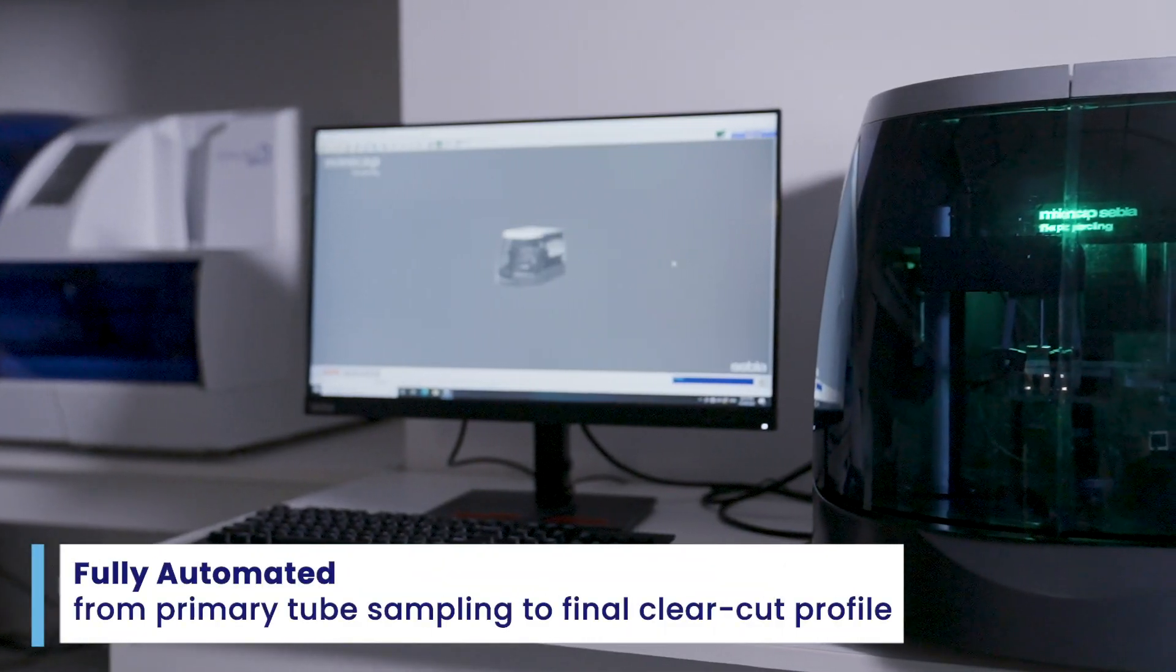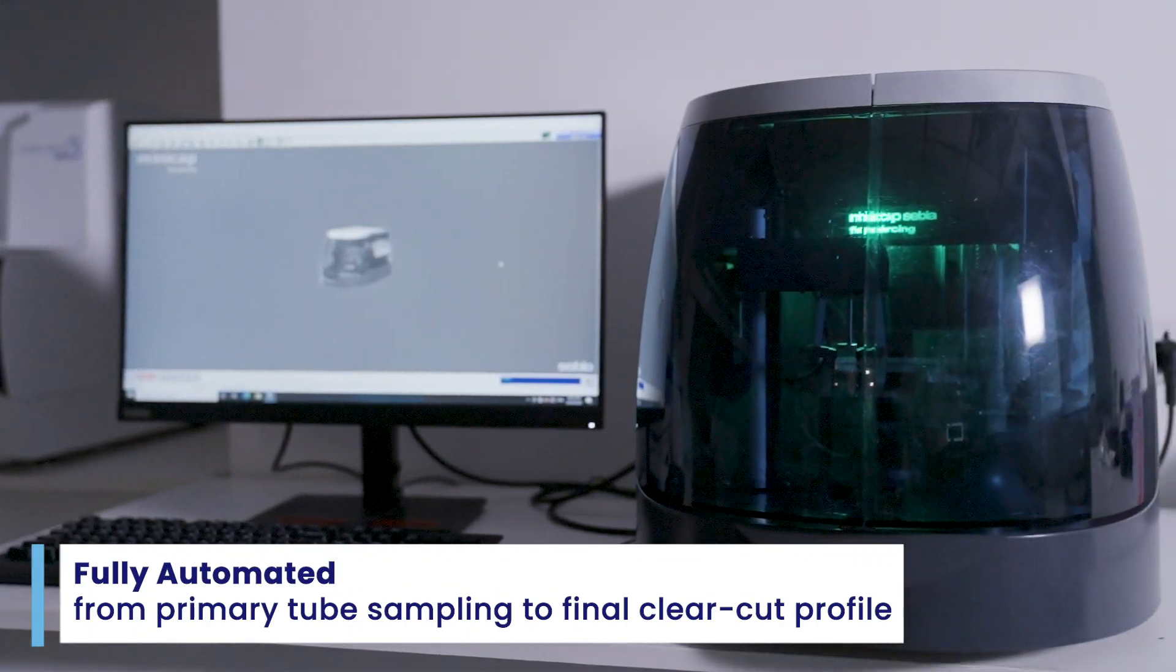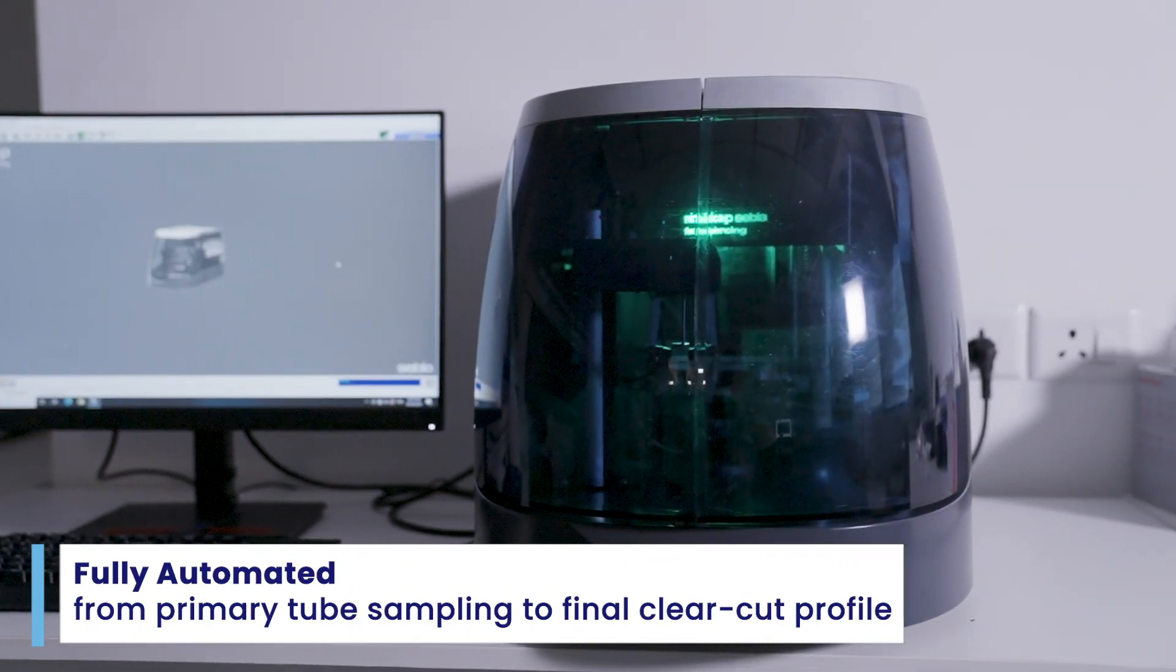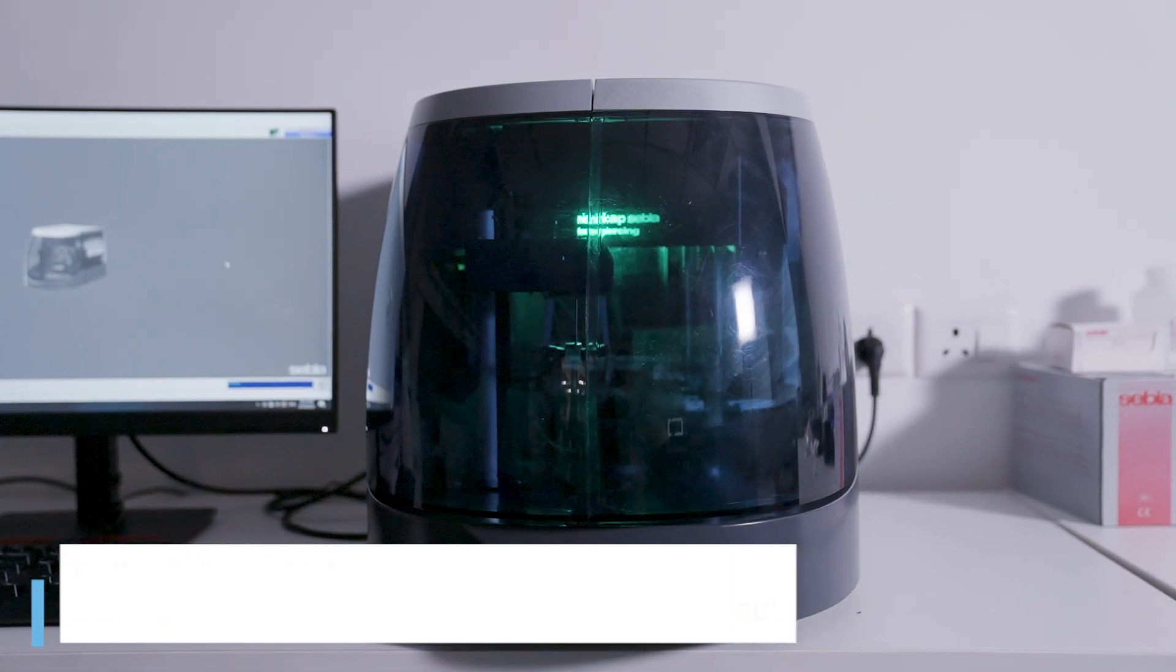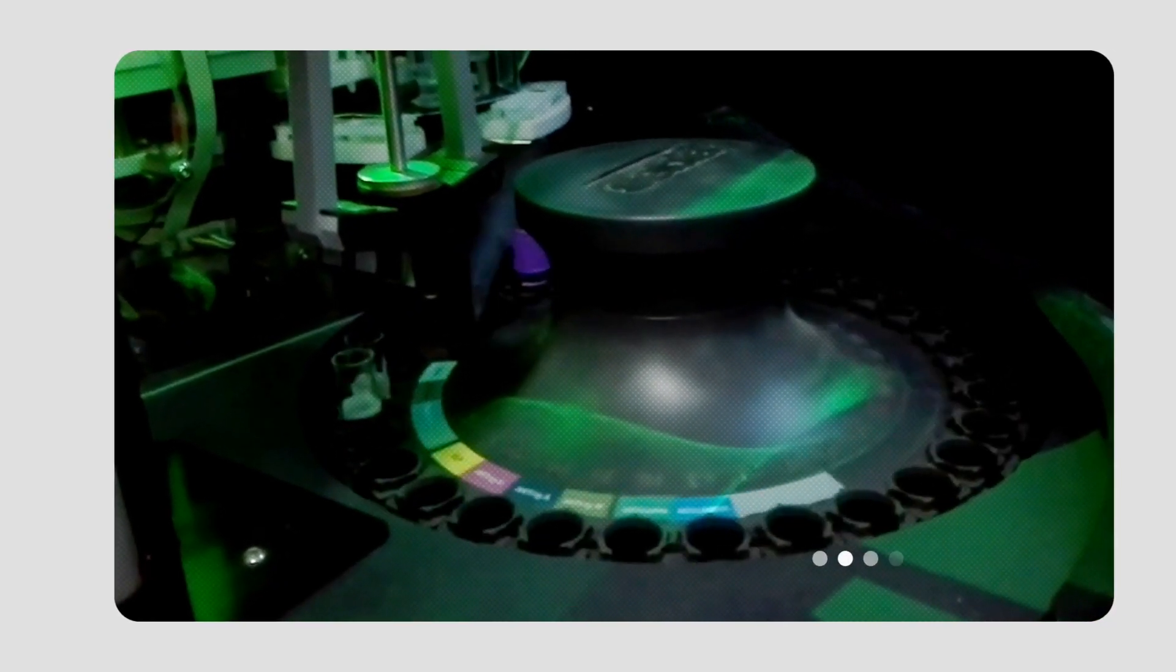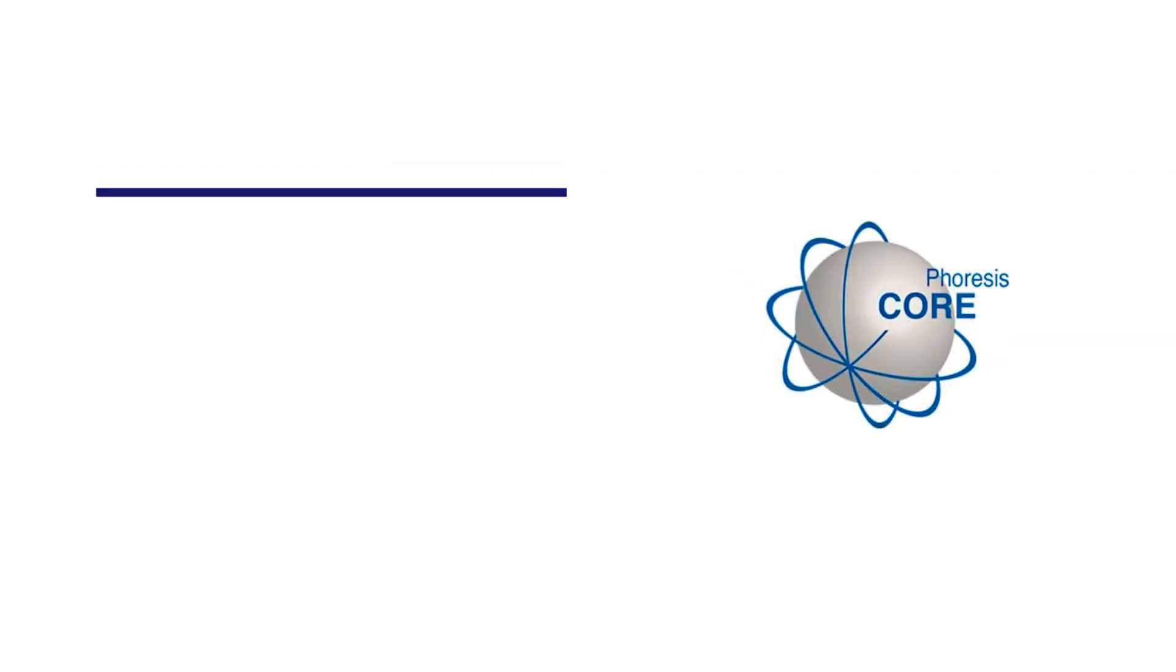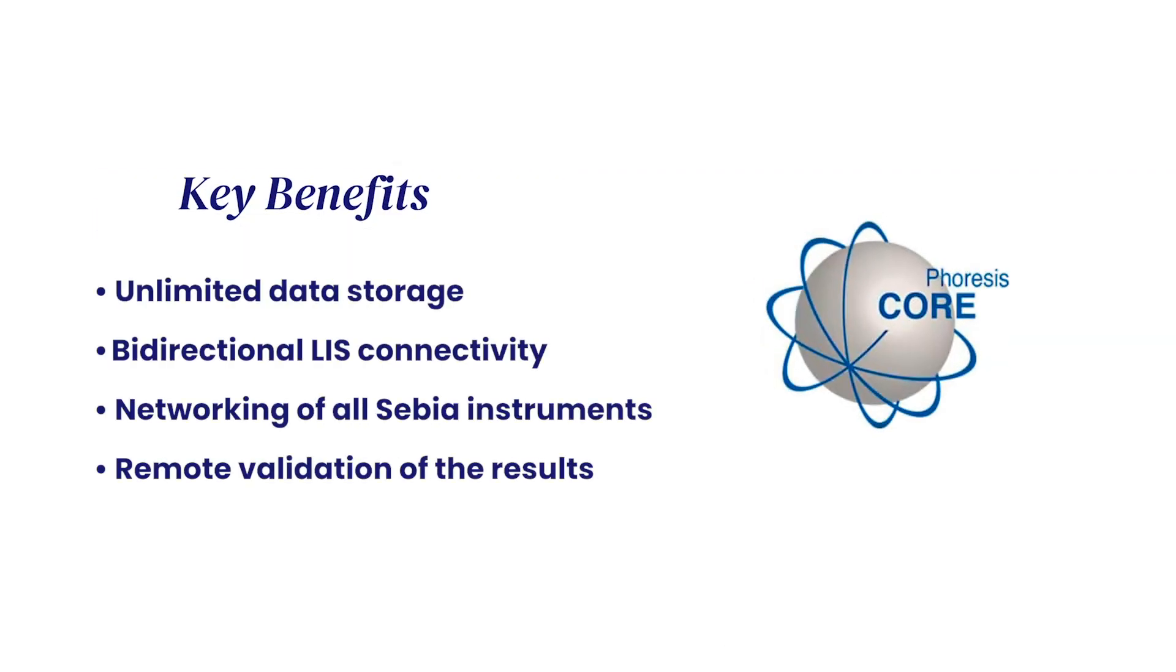Minicap instrument performs all steps automatically from primary tube sampling to final clear-cut profile with precise quantification and presumptive identification. CBR uses the same phoresis software on all gel and capillary electrophoresis platforms.